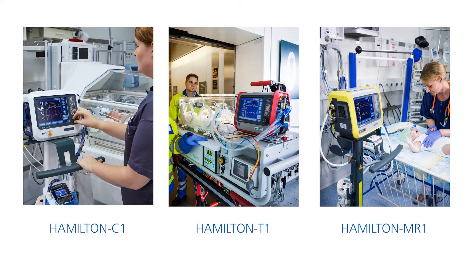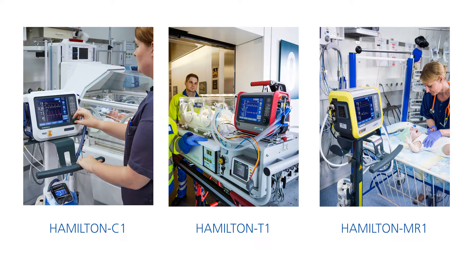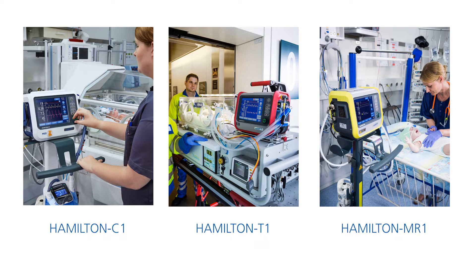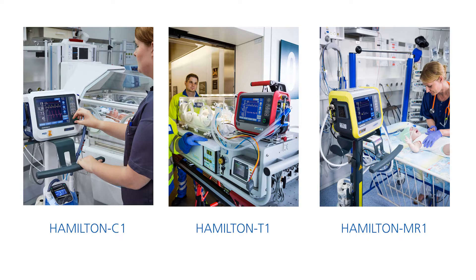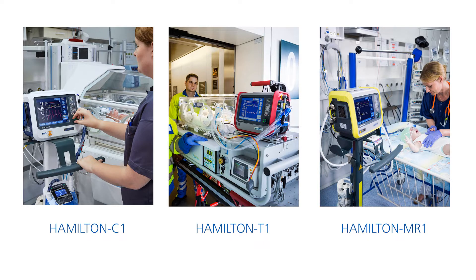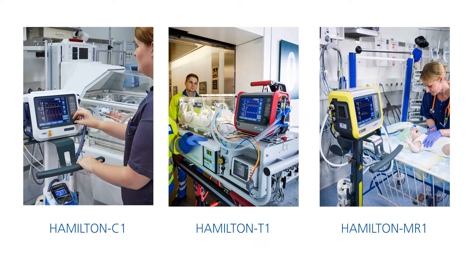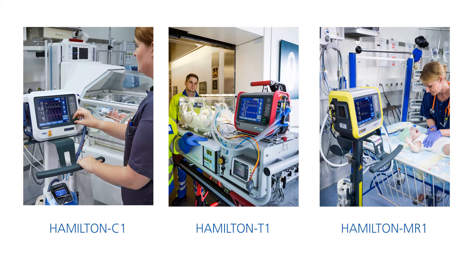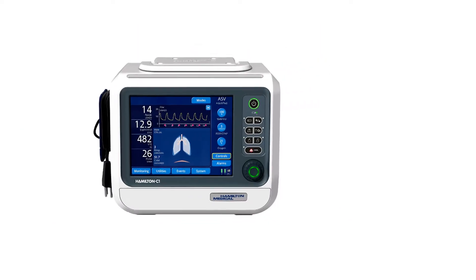The neonatal function is available for the Hamilton C1, Hamilton T1, and the Hamilton MR1. It works the same way for all three ventilators and helps you provide optimal care for even the tiniest, most fragile of patients.